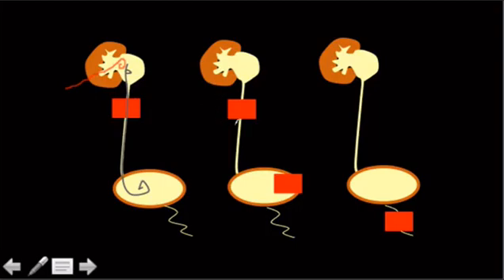All right, next situation: you've got a problem in the ureter, but also the bladder doesn't empty correctly for whatever reason. There's something wrong with the bladder. If you were to give him a double J stent, you would just be draining into a bladder that doesn't work. Then you would have urinary retention issues and all kinds of problems too. So it doesn't make sense to drain urine into a bladder that doesn't function. In this situation, he just needs a nephrostomy tube because he has to decompress here.